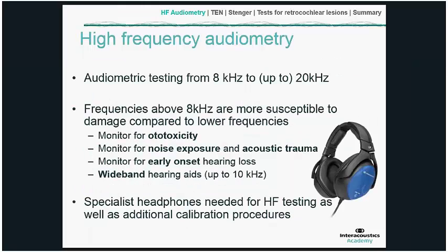This is a nice place to start, I think, because it's actually relatively straightforward from the point of view of learning new concepts, because it's the same procedure for audiometric testing as you would expect to arise in the normal audiometric range, which is typically from 250 Hz up to 8 kHz.